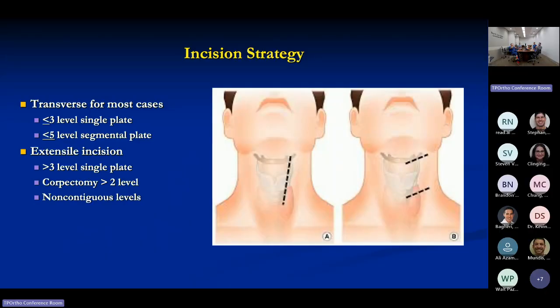And then you work your way down, pushing the head away. But when you look back in there at the end, you've actually lengthened the neck sometimes an inch. But typically you try to restrain it to 1.5 centimeters to a centimeter. When you look in your transverse incision wound at the end, you'll see it's very hard to get to the top plate because you actually incrementally push that upper level away. Anyway, it's a feasibility of allowing a long reconstruction that we used to not be able to do. And if you use a long plate, you can't really do that.